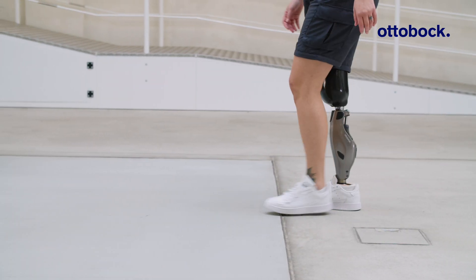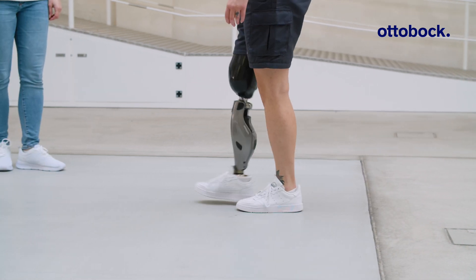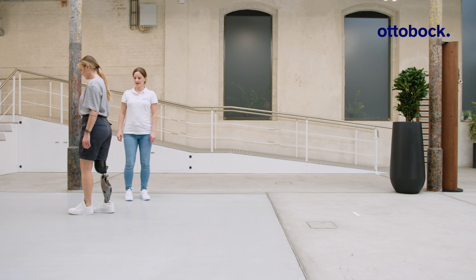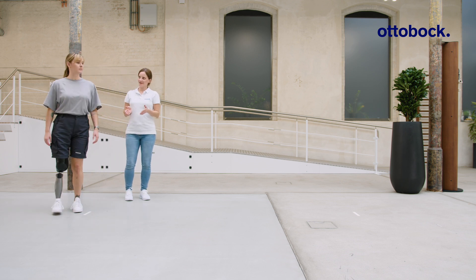Rolling over the entire foot is important as this improves the walking technique. Half the foot length is the realistic step length at which an advanced user can still walk quite fluidly.